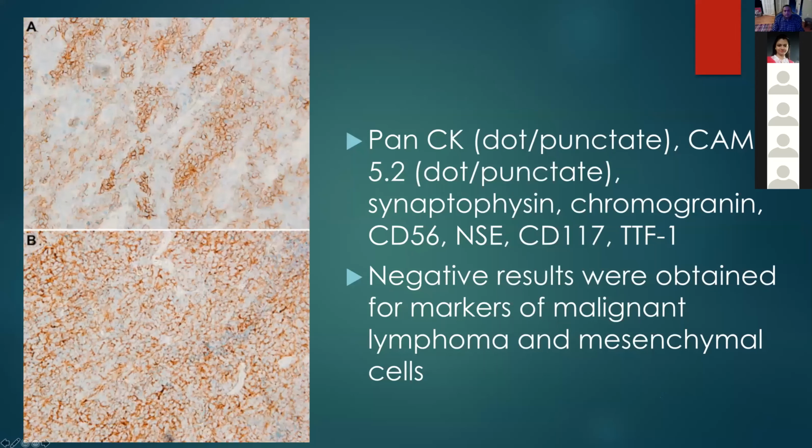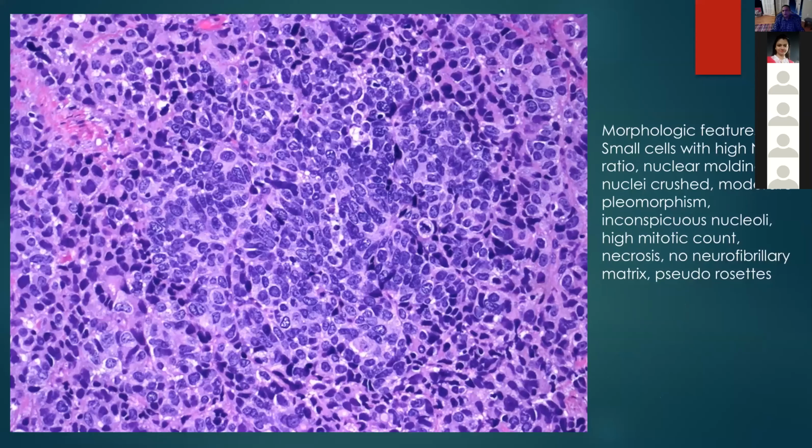So what do you see morphologically? Same thing. You see enormous numbers of small cells.